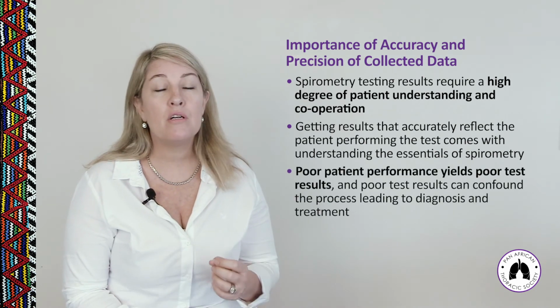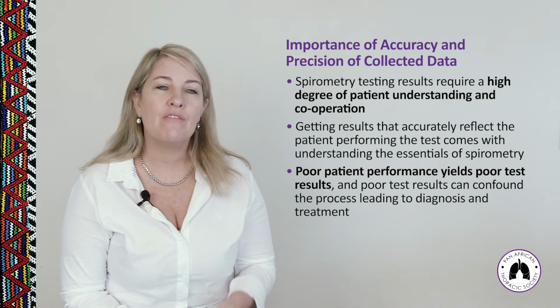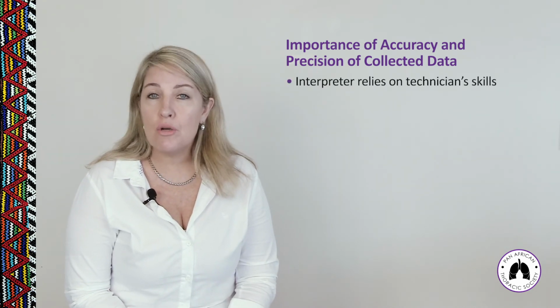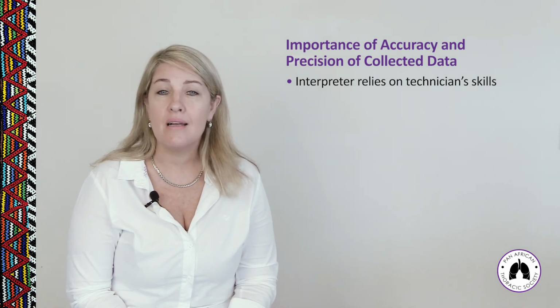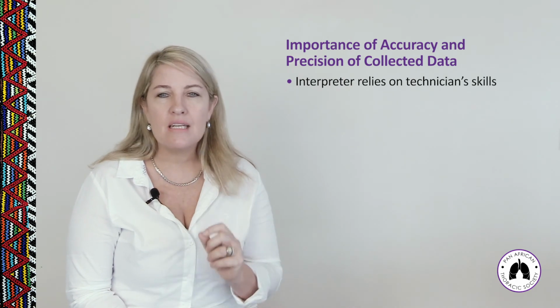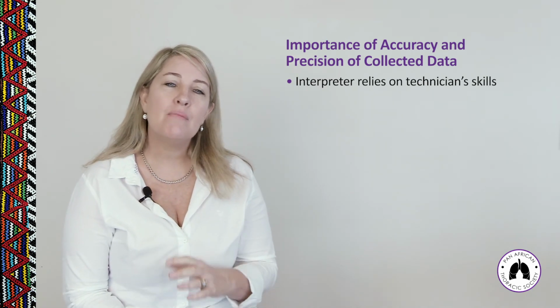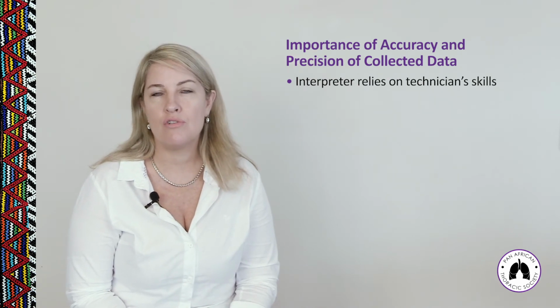Poor patient performance yields poor test results, and poor test results can confound the process leading to the diagnosis and treatment. So the person interpreting the spirometry result does not always witness the test being done, and therefore relies heavily on the technician's skills for conducting and then reporting the test result in hand to come to an accurate conclusion and interpretation of that spirometry test result.